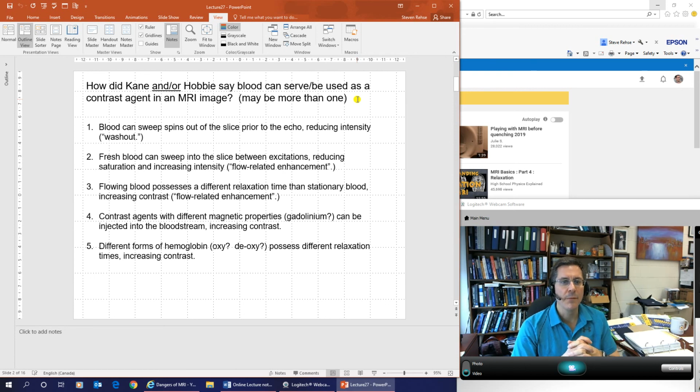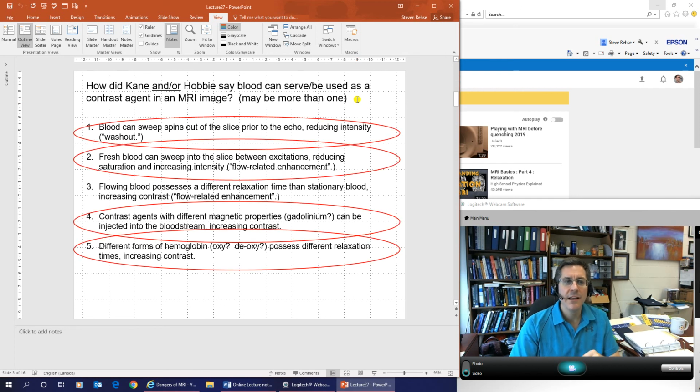Okay, so welcome back. So I told you that there were 4 correct answers to these. Which 4 do you think it was? Let's take a look. Yeah, 1, 2, 4, and 5. And we're going to see some of these in our animations today. For sure, we're exciting all the spins in a slice. That was the whole point of the slice selection gradient. And the blood, because it moves spins out of the slice, reduces the intensity. So that's called washout.